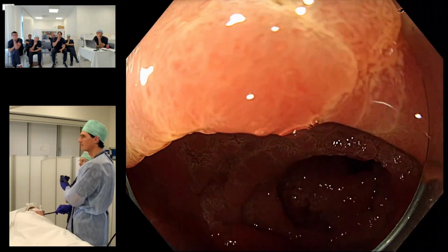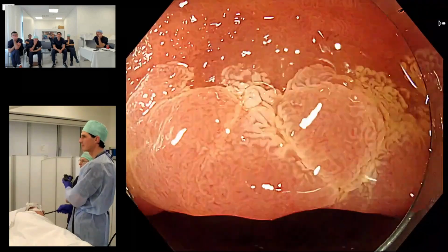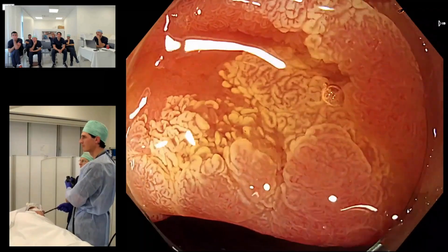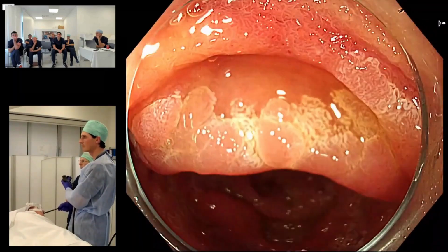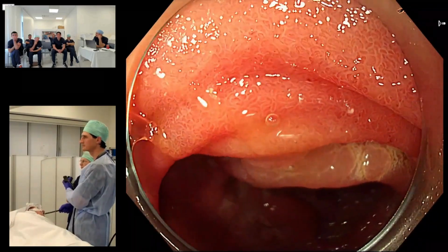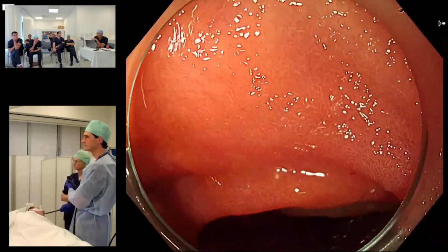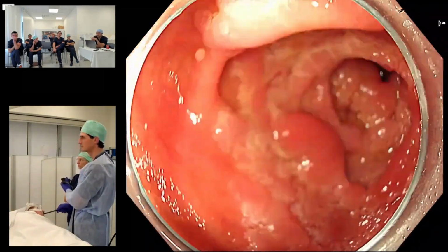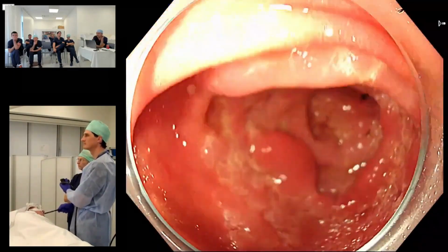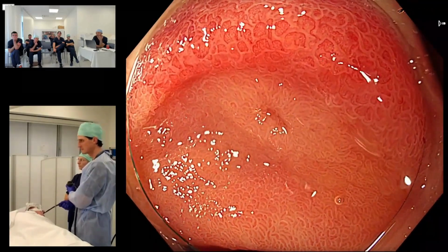That's the major. I think it's a major. It's usually difficult to see the minor papilla. If you do see it, it's usually just a small opening. I haven't seen it so far. What is the relevance of the minor papilla in this situation? Anybody? Why am I asking him to look for it? It's an additional drainage of the pancreas. Yes, in the normal anatomy, it's an additional drainage of the pancreas. But in a pancreas divisum, it is the main drainage of the pancreas. So what is the problem? Is if you have an undetected, there it is, yeah, there.